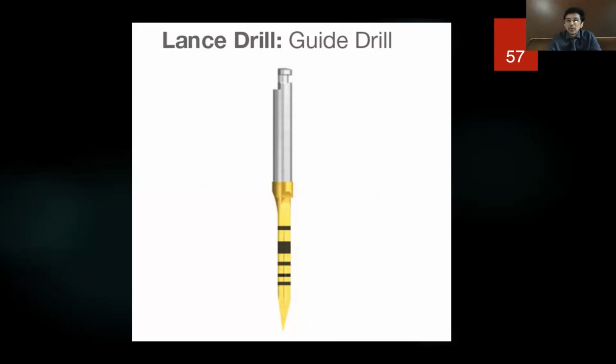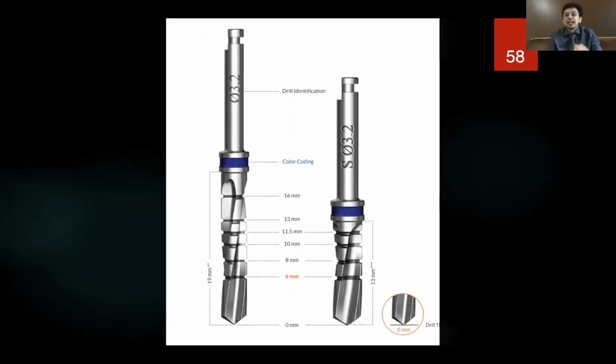Fine. So, it is the lance drill. Now, lance drill starts from just 1700 rupees onwards. So, always and always invest in a good lance drill. And again, it is lance drill, not lancet drill. Many of the people straight away say it is lancet drill. So, have you heard of lancet drill earlier? Okay, all of you have heard. Fine, majority have heard. So the next is, always keep a set of short drills with you.